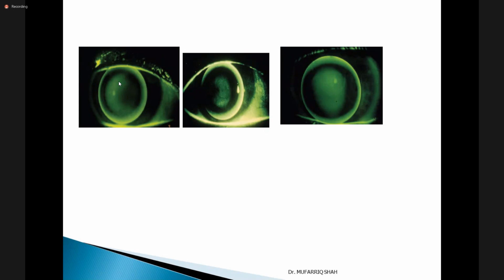Okay. First, you should see which type of lens this is. What do you think? Rose K2 KC, Rose K2 NC, Rose K2 IC, or Rose K2 PG lens. What do you think? Which type of lens is this first?